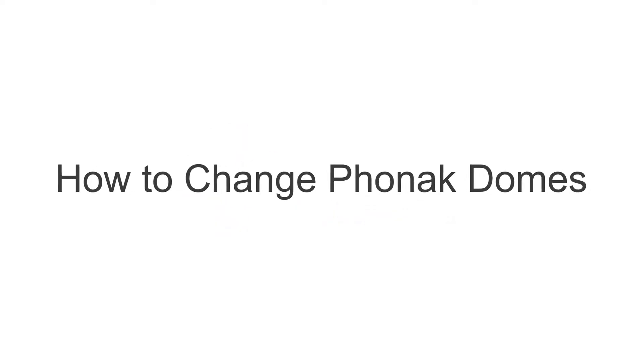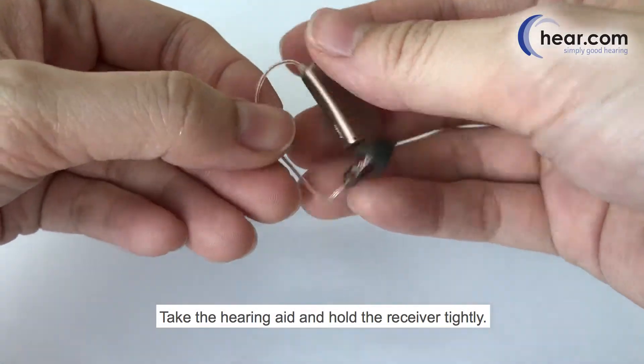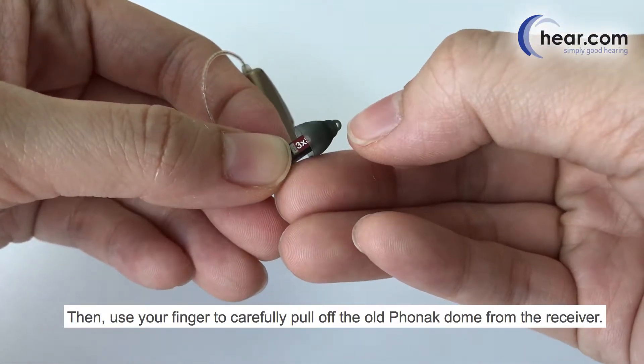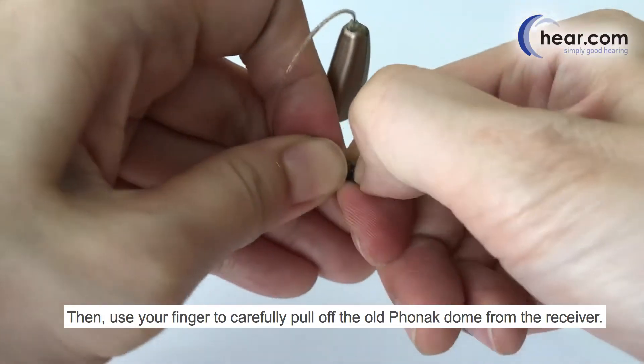How to change Phonak domes. Take the hearing aid and hold the receiver tightly. Then use your finger to carefully pull off the old Phonak dome from the receiver.